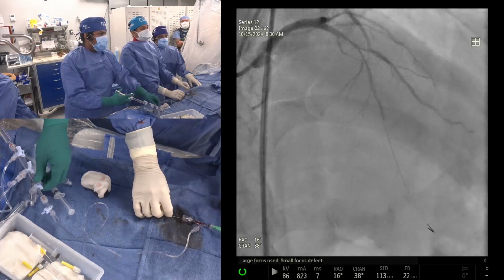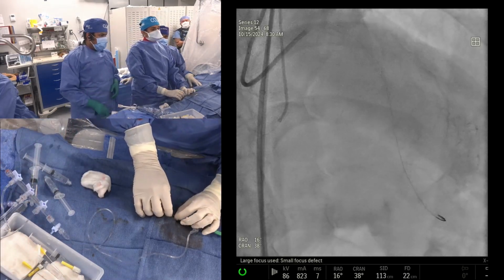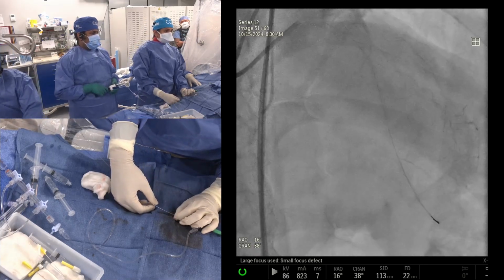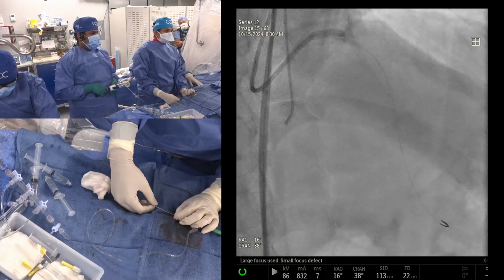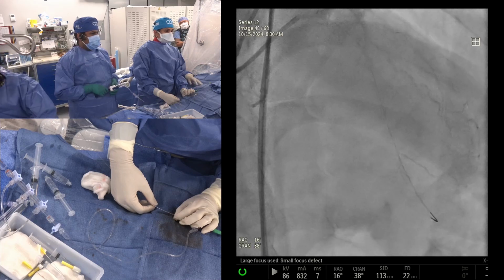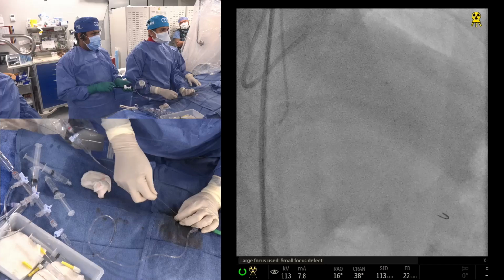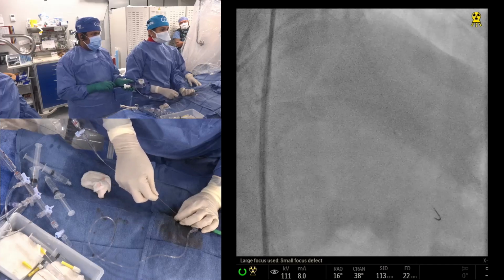Okay. Making progress. Great progress. I thought when the balloon was giving trouble, it was laser time. Go dilate with the same balloon a little bit more. Very diffuse disease. I'm trying not to balloon. Yeah, so low pressure, that's fine.